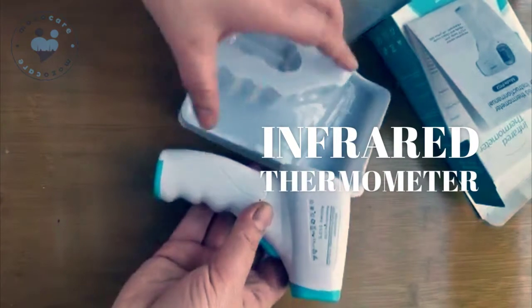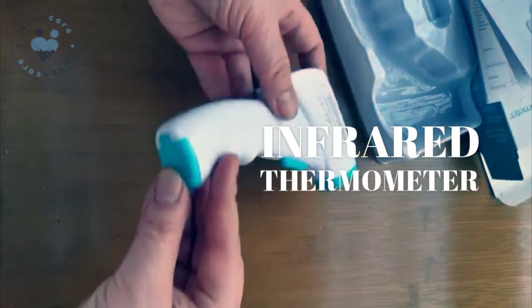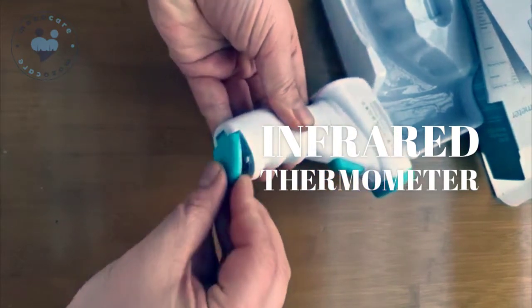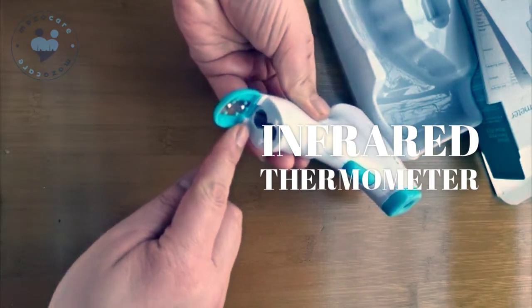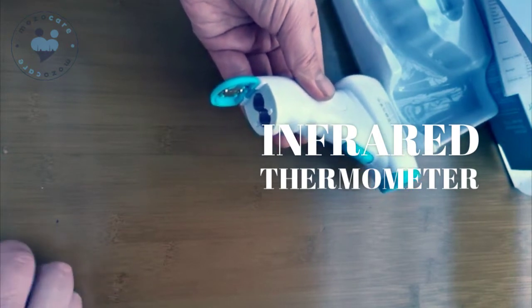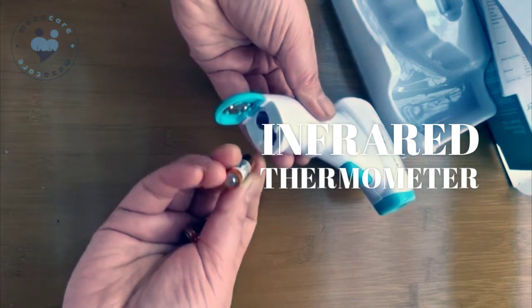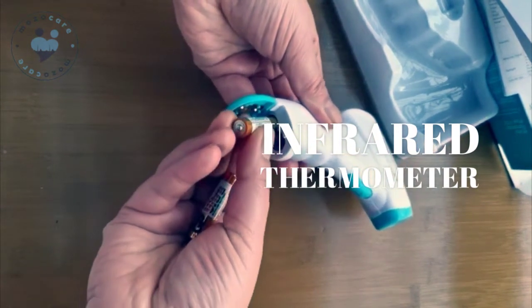In the machine there are no batteries — you need to prepare the batteries by yourself. Open it. Here you can put the batteries. Be careful to put the batteries on the right side.